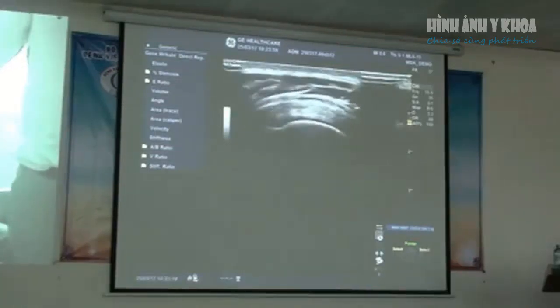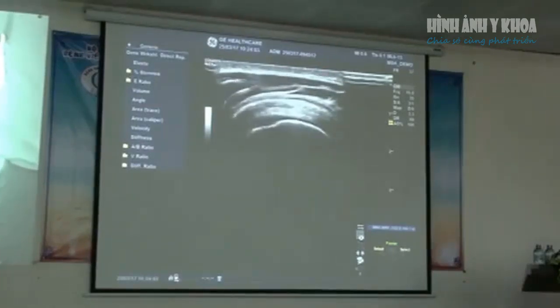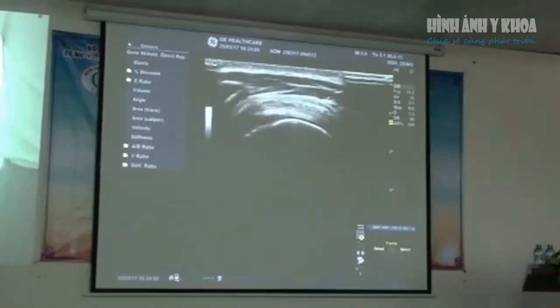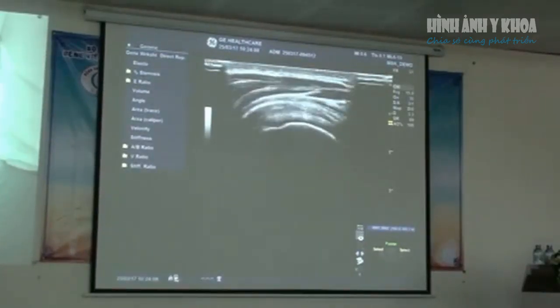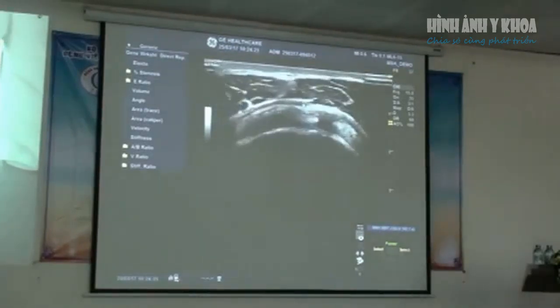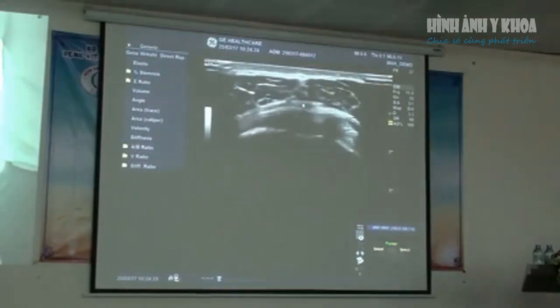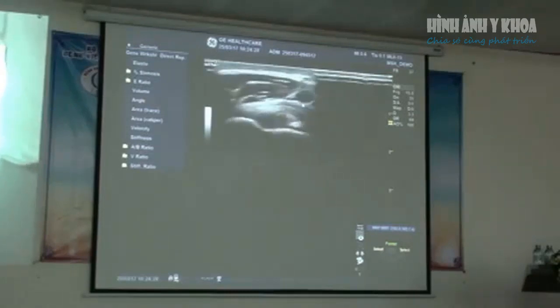So we have to constantly go back to, is this relevant to the patient's condition? Even in some patients, as I showed before, if that bursa is very thin and they still have pain when they abduct their arm, that could indicate a chronic adhesive bursa. So it is very important to always refer back to the clinical presentation.